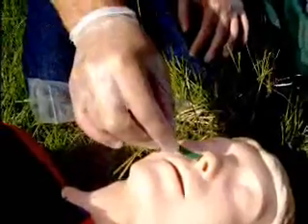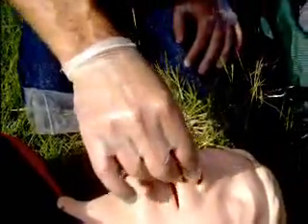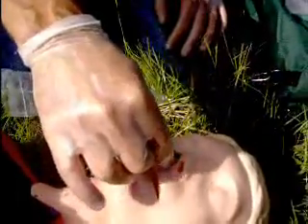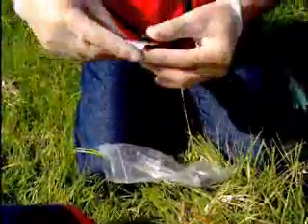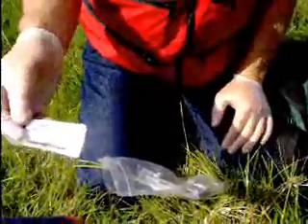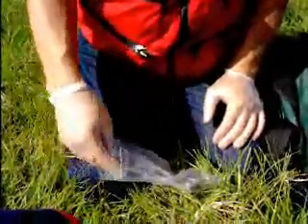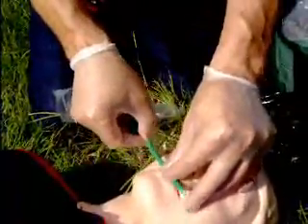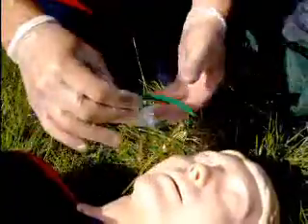And again, you put it in and rotate it as it goes in and push it on down. Now this needs lubrication. So normally you'll have some lubricant jelly along with your airways. But if you don't, you can always take the patient's saliva and put that on to do it.